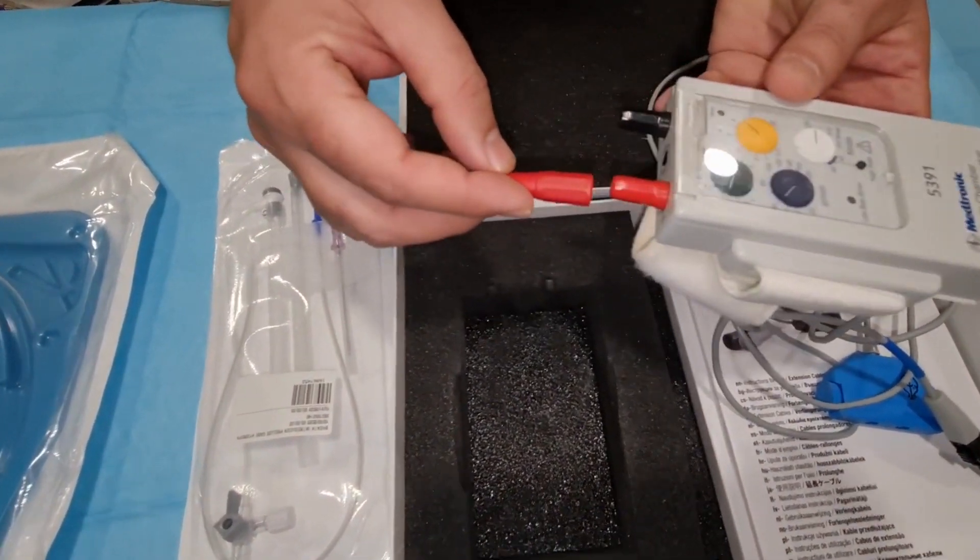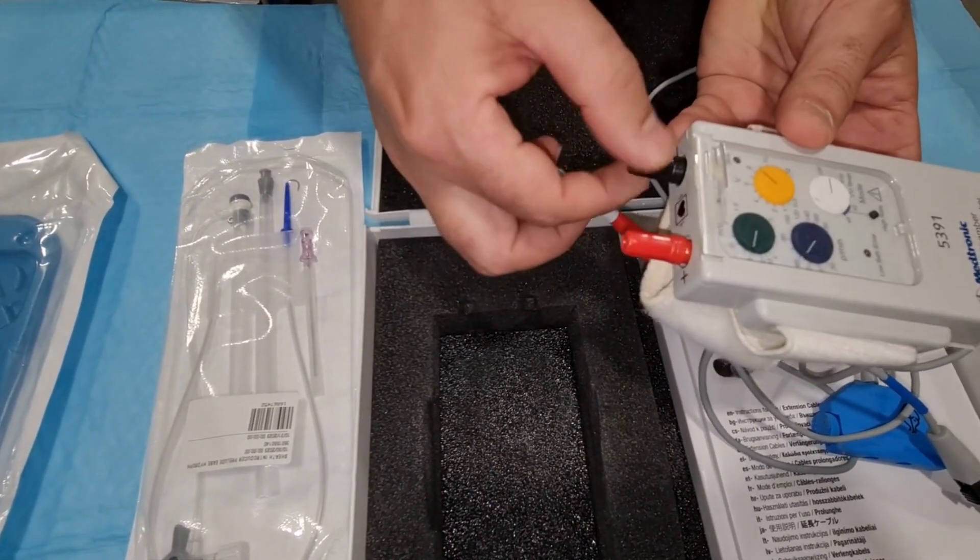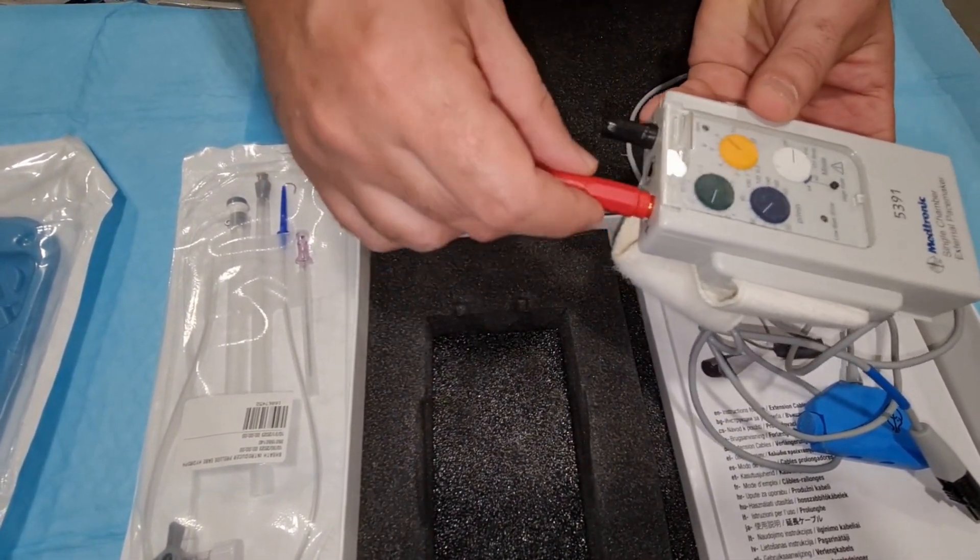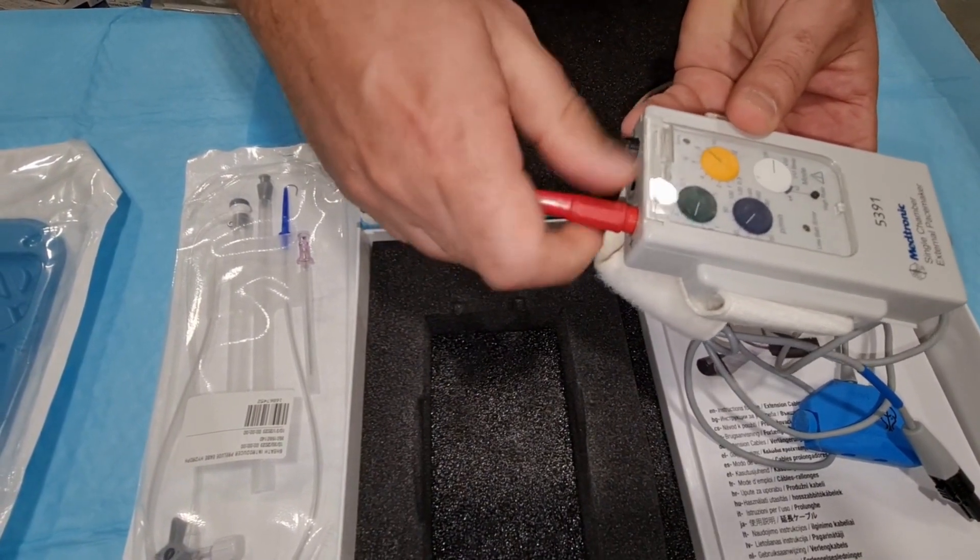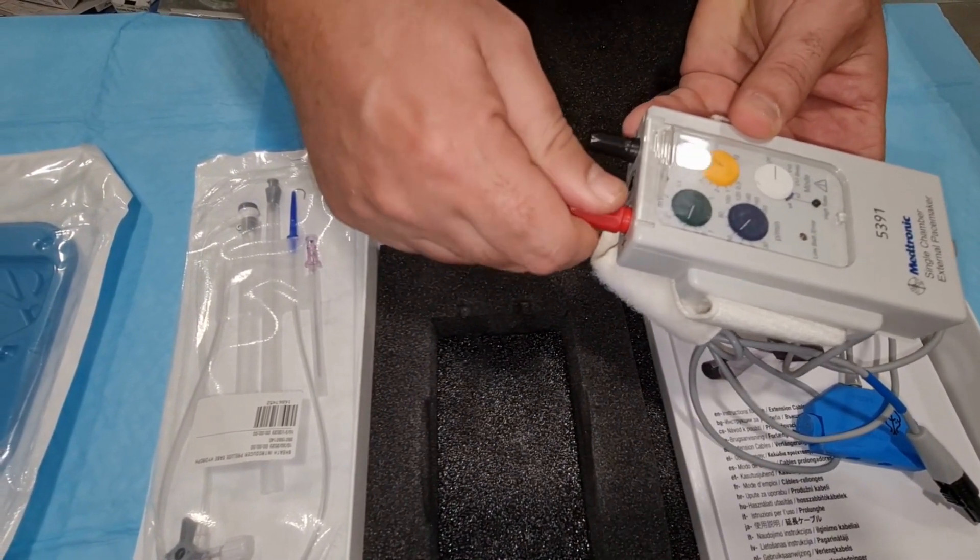Connect the red one, make it loosen first. Connect the red one, rotate it clockwise and tighten.